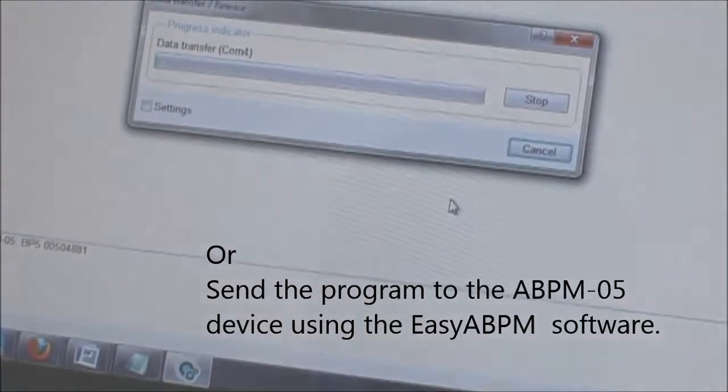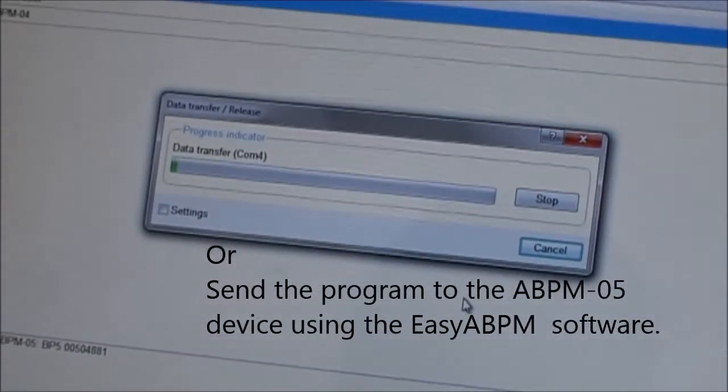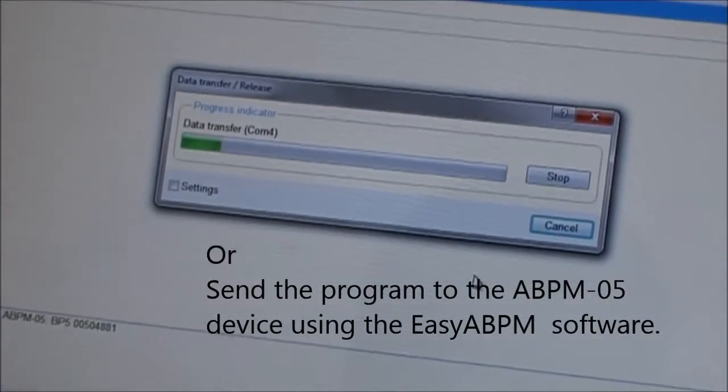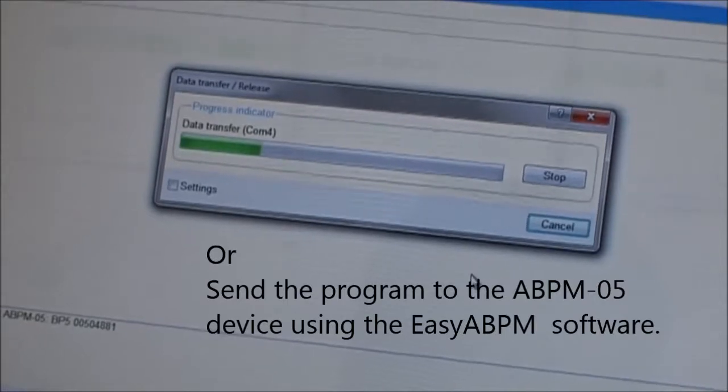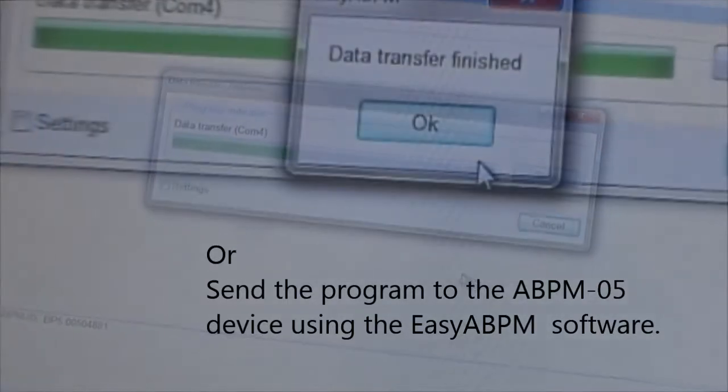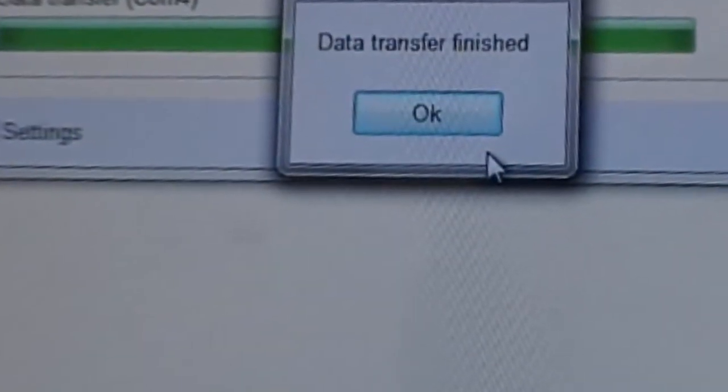There is no need to switch on or off the device. The program will start according to the scheduled time.